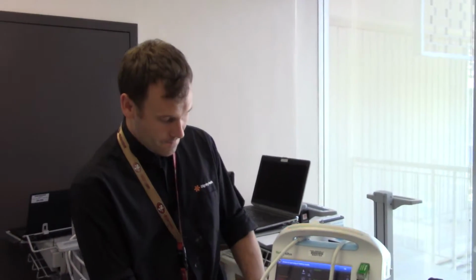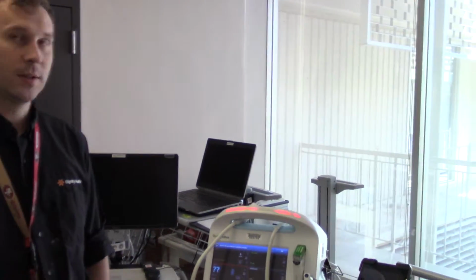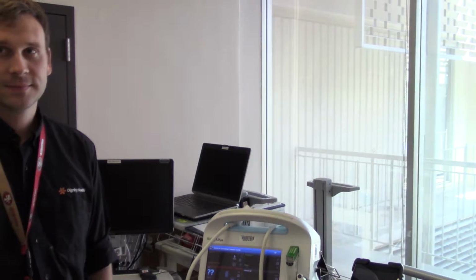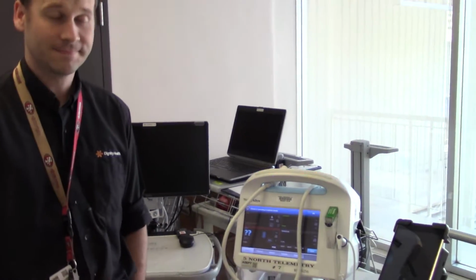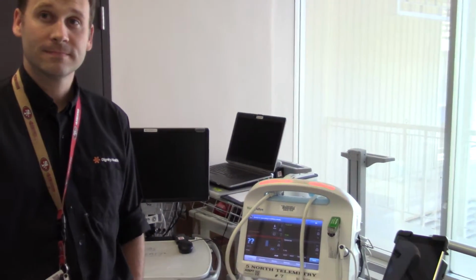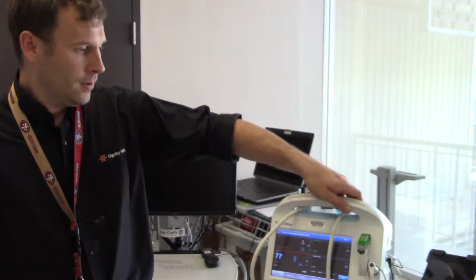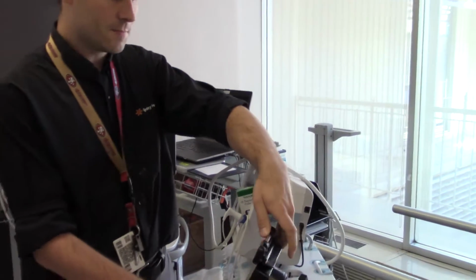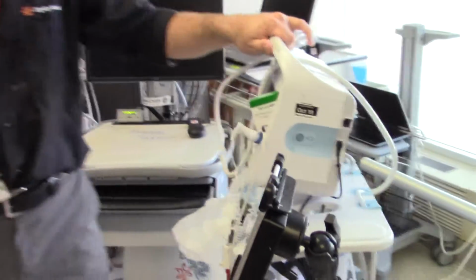And today we're here taking a look at the ADEPT station, the way they're put together with their pieces and parts, because there are probably some improvements we could make. We want to take an in-depth understanding of where the challenges are and how the pieces and parts are. I'm putting this together for a couple engineers at ASI, so they really have a good idea of how this thing is put together. Sounds good. So where should we start?